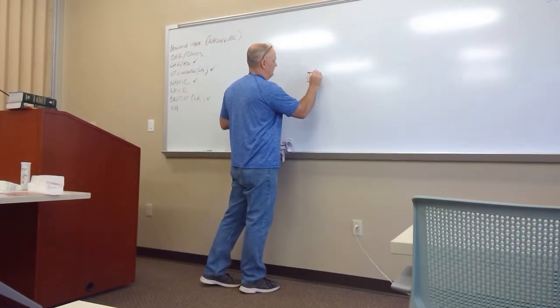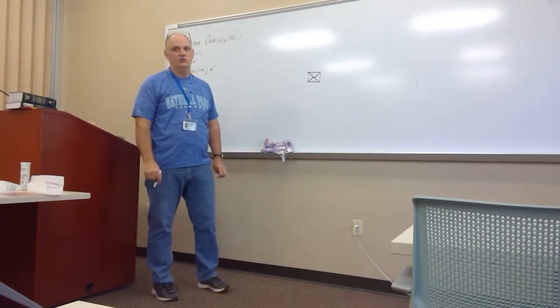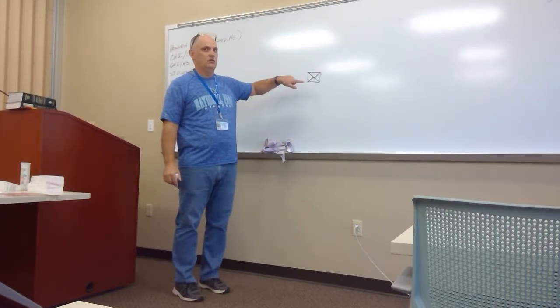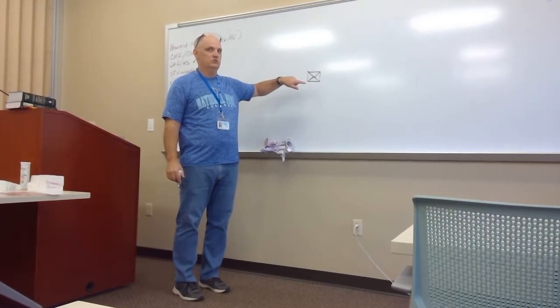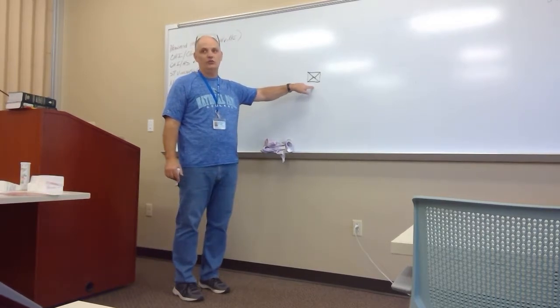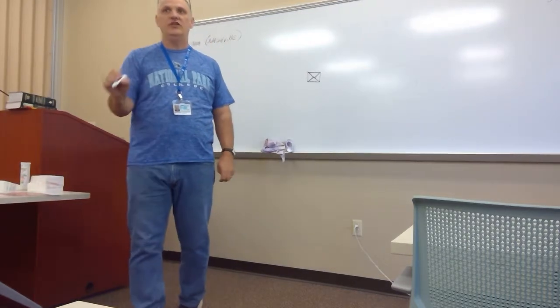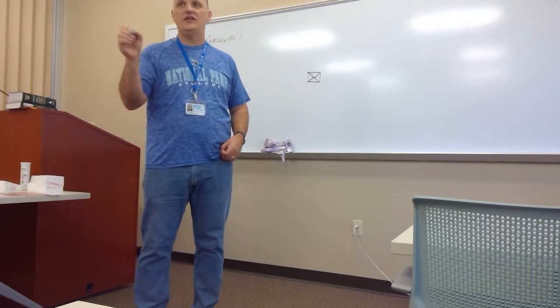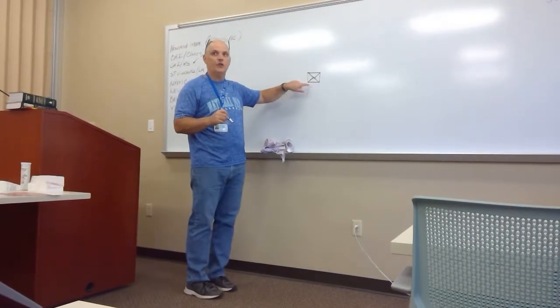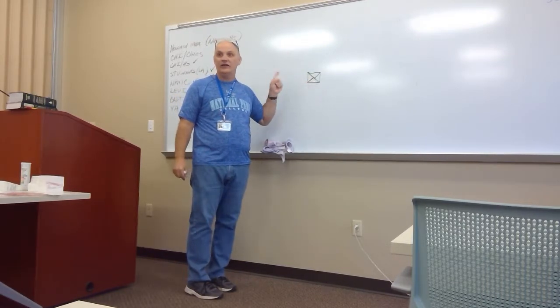Yeah, there's one on 133. Does it say acidic urine or does it say neutral? It says dihydrate calcium. All right, in the chart it says acid/neutral, and then in parentheses it says alkaline. Yeah. I want you to think of this as an acidic or a neutral crystal. If somebody's trying to explain it to you in a test question or on your registry, they're gonna say that it's shaped like an envelope. You see an envelope there, kinda? Yes. Okay? They can be small, they can be big, but this is a calcium oxalate crystal.